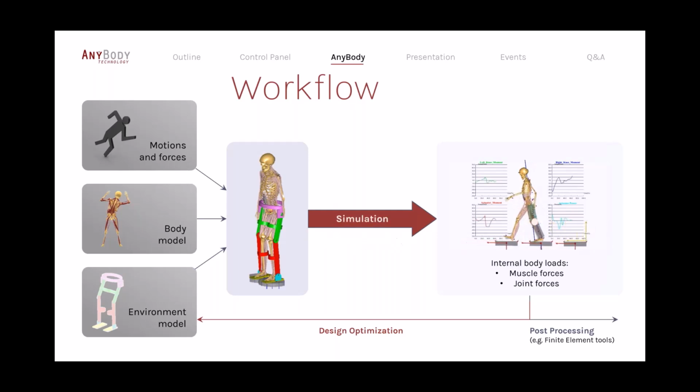You can then output the result and use it for some kind of post-processing, which could be with, for example, a finite element tool. But there's also many users who choose to complete this loop by doing some kind of design optimization and then run this cycle multiple times.